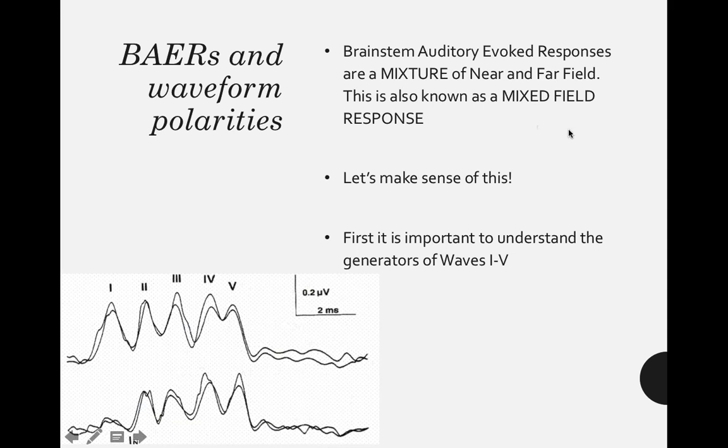So this is called a mixed field response. With SSEPs, we had near field responses and far field responses, and for SSEPs, those are pretty much considered separate. With brainstem auditory evoked responses, we have both near field and far field responses together.